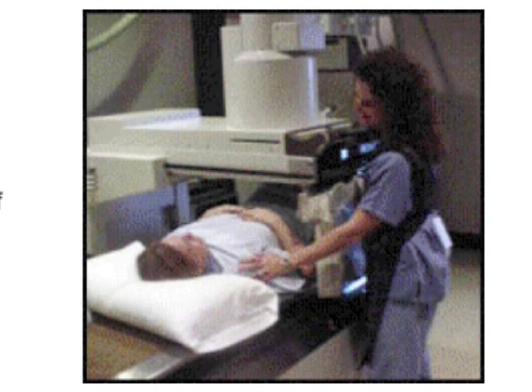But you have to be careful when you're using an open back apron that the apron is always facing the beam. If you turn around, what's going to happen? You're going to get exposed. So if you're working with fluoroscopy, if you're stepping on the pedal and you're working with other staff, be aware of people moving around the room. If somebody turns around and you step on the pedal, they're going to be really upset that you exposed them.